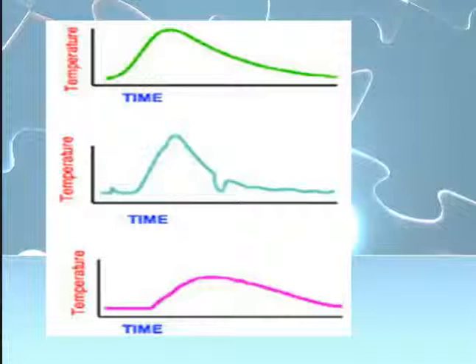In the middle there, that's obviously not smooth. You can see that there's little divots here, there, and everywhere. And the one at the bottom also looks like they were barely injecting. It took them a while to get started. It's a prolonged waveform. It's not a good waveform.